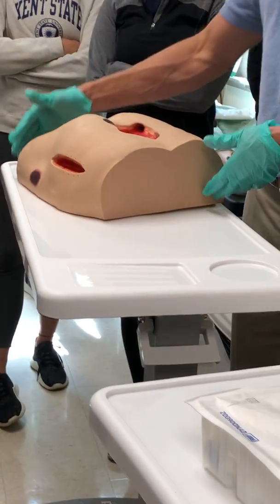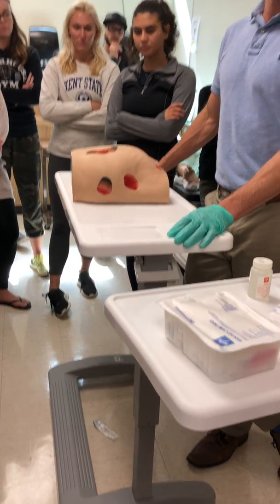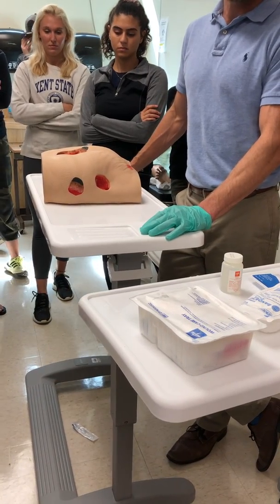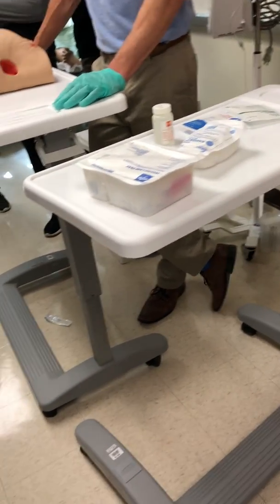Okay. Do you measure everything? Great question. We don't usually anymore. We used to, and we realized we're not really seeing any progress except once a week. So we usually measure once a week. At my hospital, it's on Mondays. Good question. I need another set of cotton tip applicators. Inside of the Ziploc bag there, you'll see more. The Ziploc bag. Yeah, thanks.